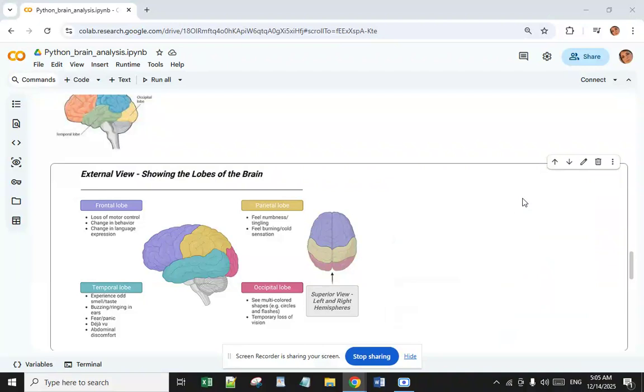Nilearn enables approachable and versatile analysis of brain volumes and surfaces. It provides statistical and machine learning tools with instructive documentation and open community. It supports general linear model or GLM based analysis and leverages the scikit-learn Python toolbox for multivariate statistics with applications such as predictive modeling, classification, decoding, or connectivity analysis.